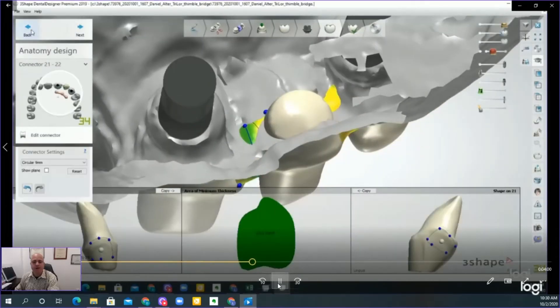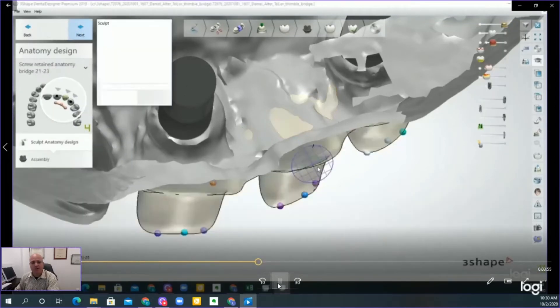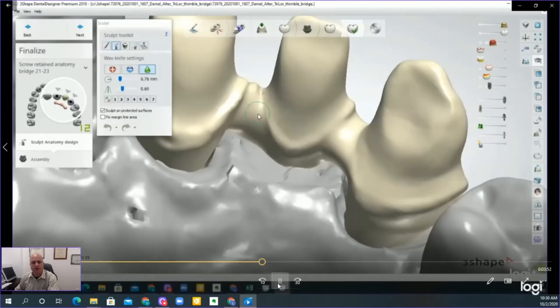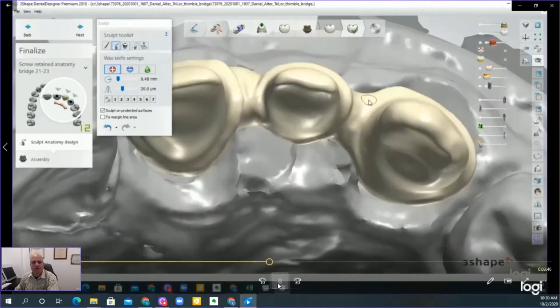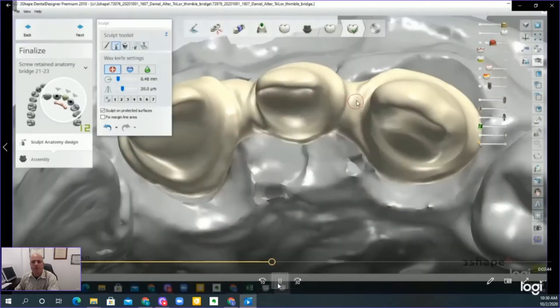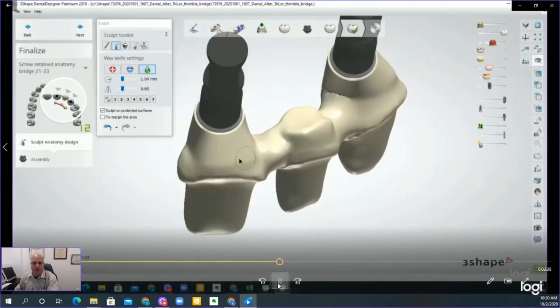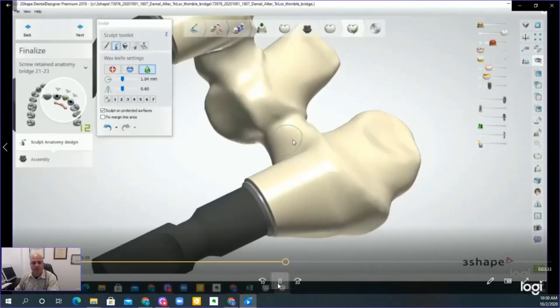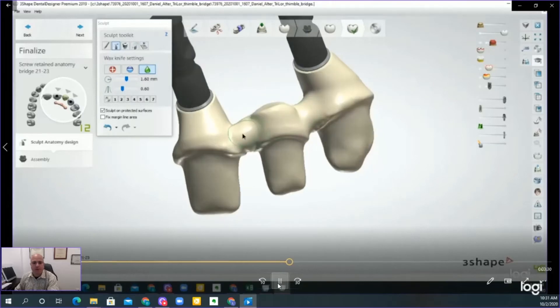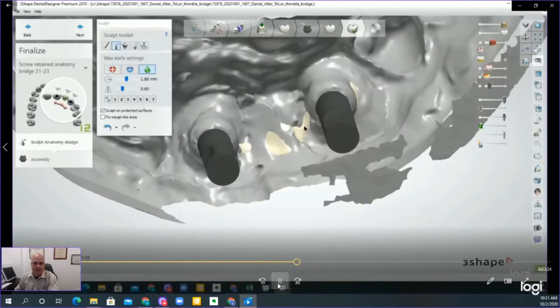You can adjust it further. Here you can see that I accidentally forgot the pontic area, so I was able to go back and reduce it right up to the saddle area. Using the wax knife, you can bring up your margins in certain areas if needed, as seen here in the video. I suggest smoothing out any areas you want to — not so much for the design, but certainly for manufacturing and milling. Any irregularities create a spot for tooling error or tooling breakage, which is something you don't want.